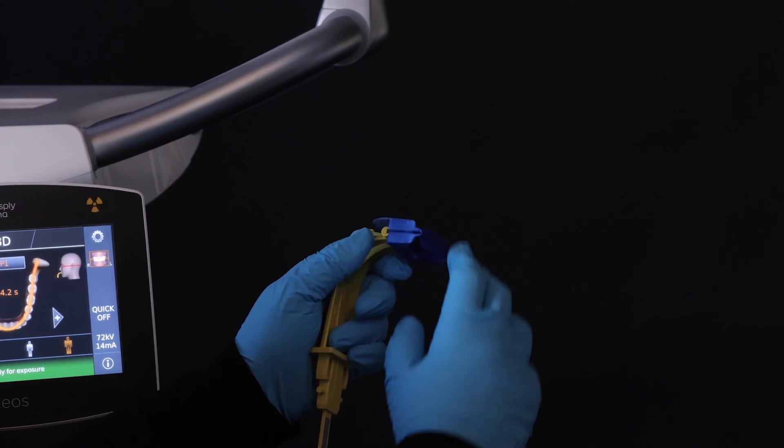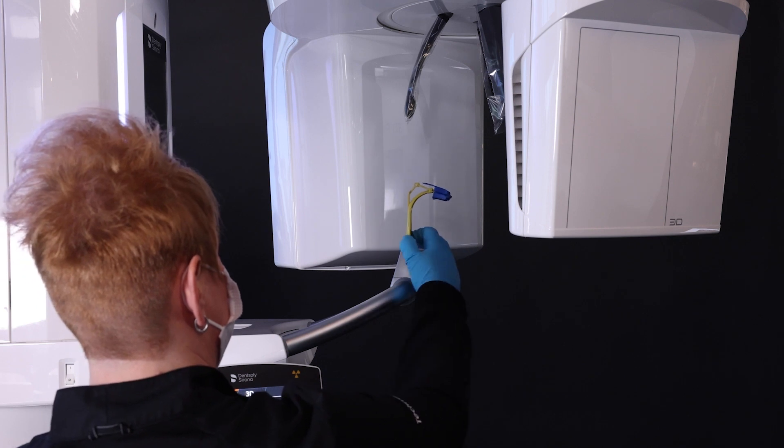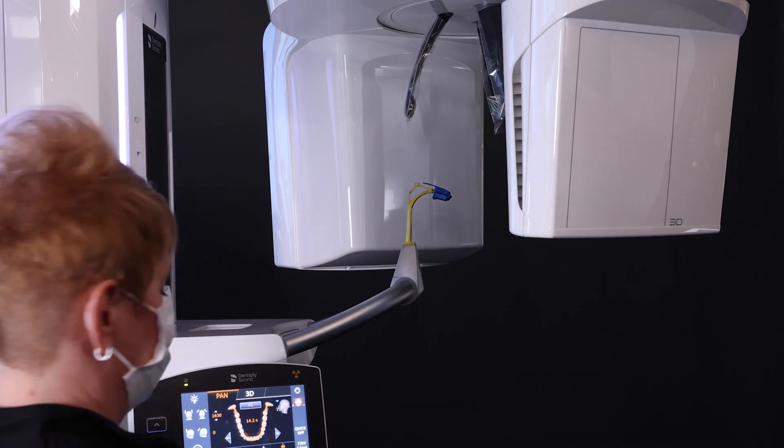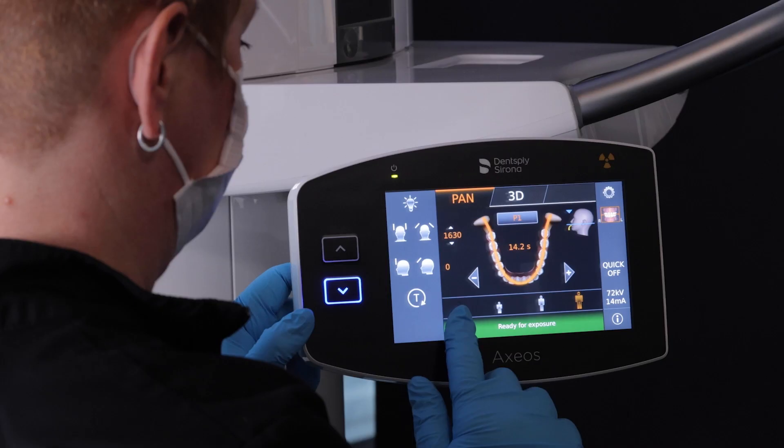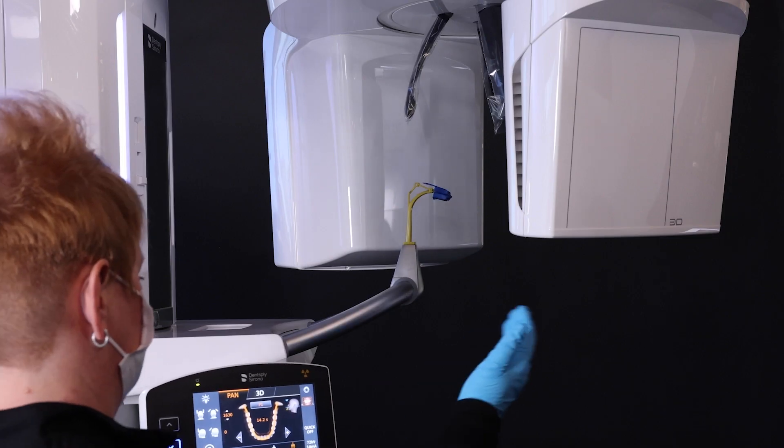To take a panoramic image with the Auto Positioner, first insert the disposable blue foam into the bite block and place in the machine. Confirm the desired program and patient size on the touchpad. Adjust the machine height to the patient's occlusal plane.